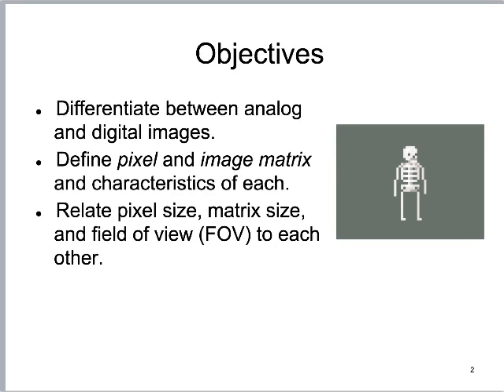And then there's contrast resolution: can I see it in terms of color? Sometimes we talk about spatial resolution as being high contrast resolution. Those terms are interchangeable. We can talk about spatial resolution and high contrast resolution, and they're essentially the same thing.